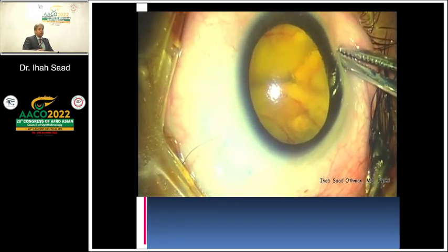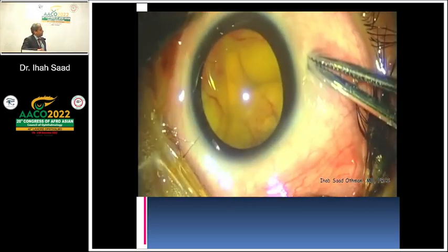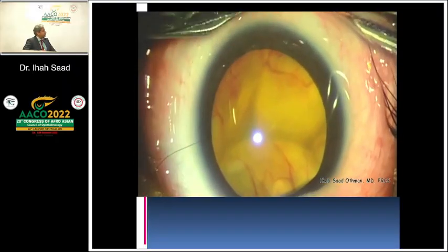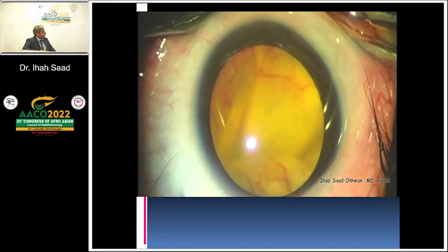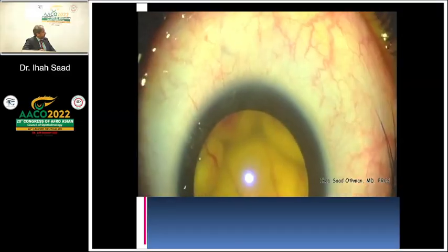The typical management is, again, to make sure one more time in the OR, before any surgical decision, that this is not a malignancy, this is not a mass. And we look thoroughly at the periphery to identify one more time the telangiectasia, which you can appreciate in the quadrants here.